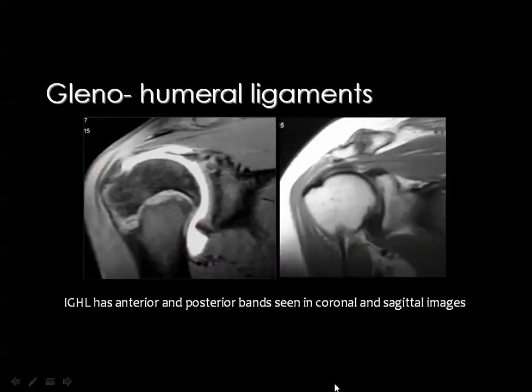I mentioned that we have many types of slap injuries, but actually these 4 types are enough to be known for those who are practicing general radiology. But those practicing the musculoskeletal imaging will know more in the range of 7 types of slap injuries. And those who are handling only the shoulder will know about 12 types of slap injuries, and those who are concerned only in the labral pathology will know the 18 types of slap injuries.